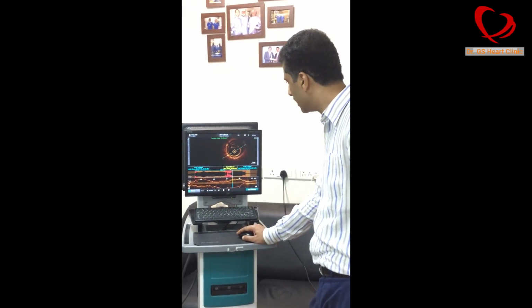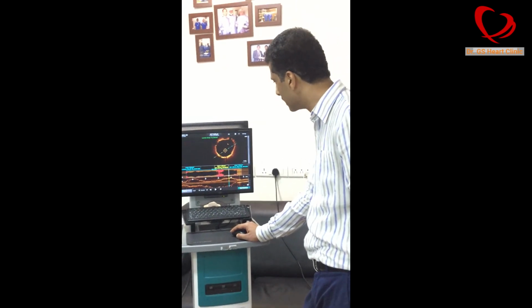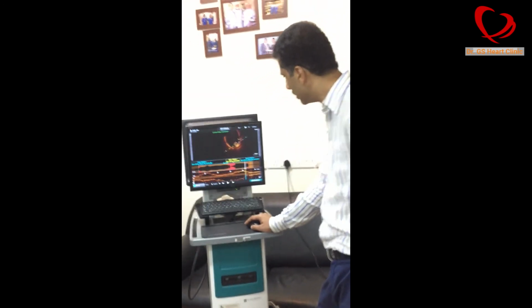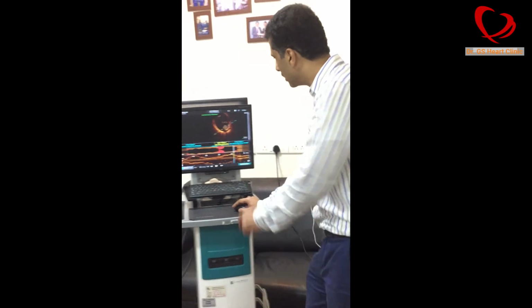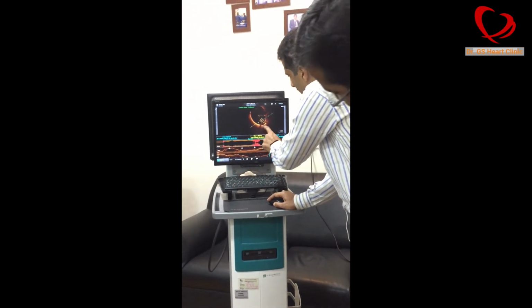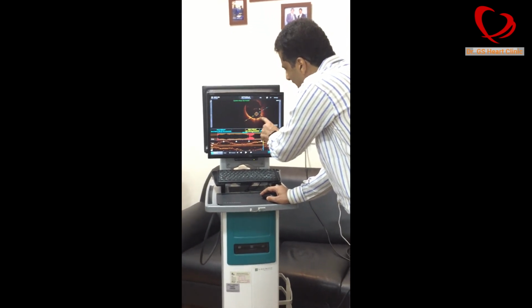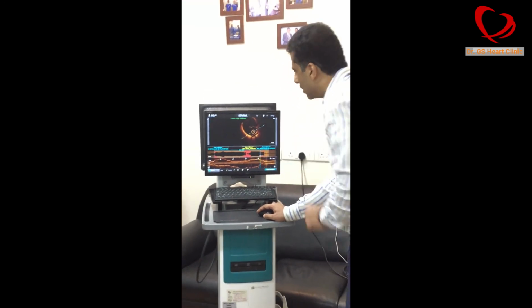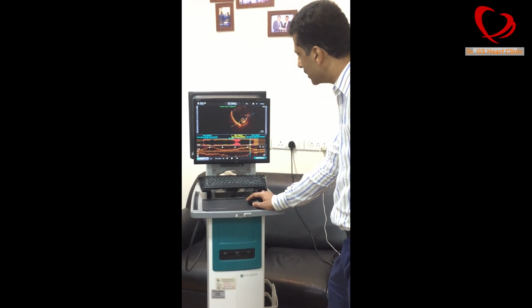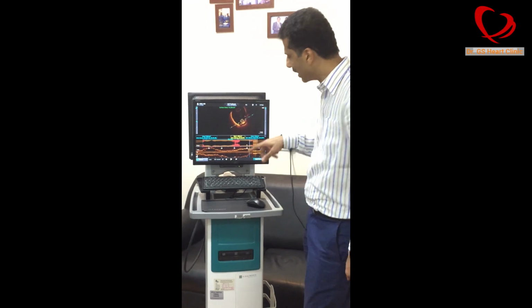But if you look at the edge of the stent, because we postdilated it excessively, you look at the stent edge. I'll show it to you. See this? Can you see this? There's a small area where the vessel is a little bit hurt, there's an edge dissection. Can you see that? There's a cut. There's a small cut beyond the stent, not in the stent, after the stent. So that is why we decided to put a small 8mm stent and cover it.